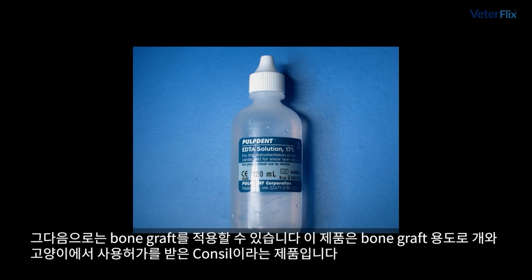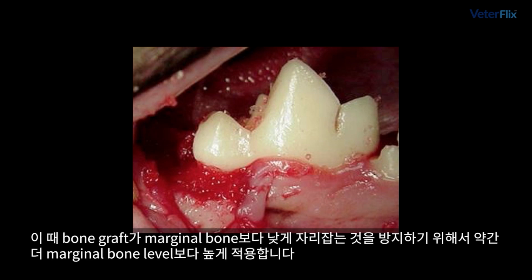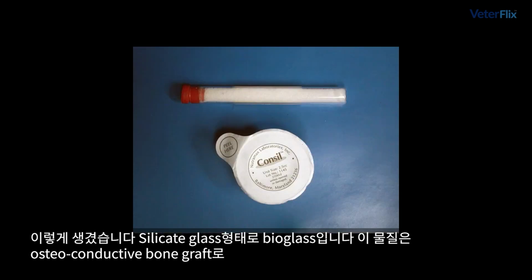So once that's done, we can place a bone graft. This is Consil, which is approved for use in dogs and cats for this purpose. And you can see it's placed above the level of the marginal bone, and there's a reason for that. We don't want it to settle and go below the level. So we place it a little bit with the positive meniscus here, a little bit above the level of the marginal bone. And this is what it looks like.